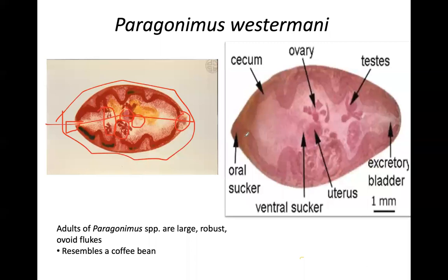And so where do we expect to get the samples of Paragonimus westermani? Is it in a stool sample or in a blood sample or where? Sputum, yes. All right, good.